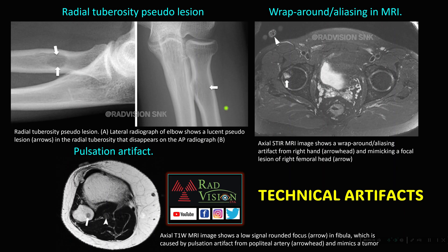Normal technical artifacts can also mimic lesions. A lucent lesion seen on a lateral elbow radiograph representing the radial tuberosity disappears on AP view — a pseudo-lesion. In MRI, wraparound or aliasing artifacts can mimic a focal lesion in the femoral head, and pulsation artifacts from the popliteal artery can mimic a lesion in the fibula. These are technical artifacts that should be recognized.